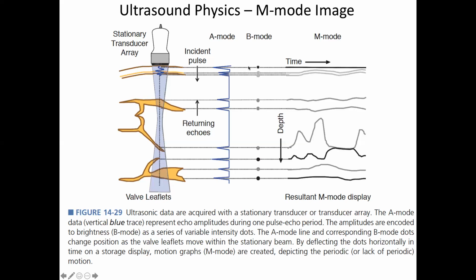And if we leave the transducer in that position and we scan at, what were we scanning at? We're scanning at 2 kilohertz, right? So you just put the transducer there, scan at 2 kilohertz and see what happens, right? It's pretty cool because these surfaces, when they're moving, you can measure with tremendous temporal sampling the motion of those surfaces, right? That's why when you look at an ultrasound image of a beating heart of a fetus or blood flow in somebody's vessel in their arm, it looks fantastic, because you get really good temporal resolution.